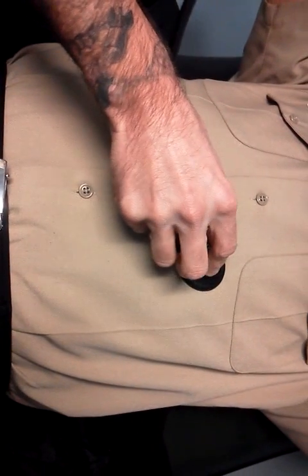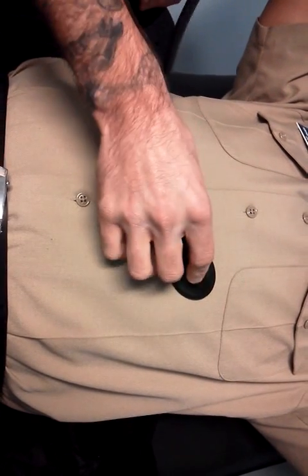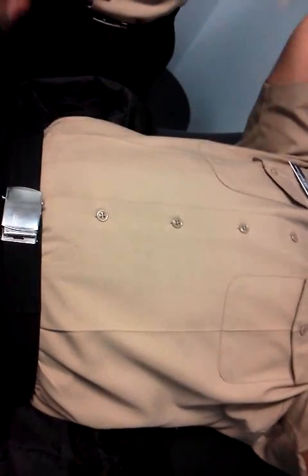So you want to do all the abdominal quadrants, okay? So you're going to go ahead and listen, and you're listening for bowel sounds. And you want to leave the stethoscope on the skin until you hear a sound, usually 3 to 5 seconds is your normal sounds, but you're listening for those bowel sounds, and you're listening for anything like borborygmi, which would be like hyperactive, kind of gurgling bowel sounds. Absent bowel sounds, you need to leave the stethoscope on that quadrant for at least 5 minutes each. So 1, 5 minutes, 2, 5 minutes, yada, yada, yada. And then you can say absent bowel sounds.